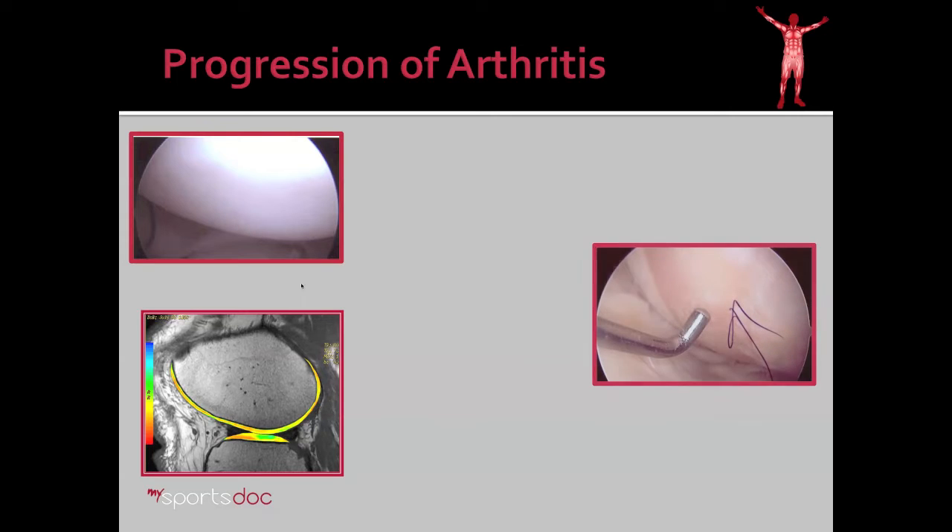Now, in contrast to that, here is a knee that's severely arthritic. The white cartilage is gone, and you have a more yellowish-brown bone which is exposed — this is bone-on-bone arthritis. This arthritis is fairly severe, and there's really no definitive treatment other than a knee replacement.